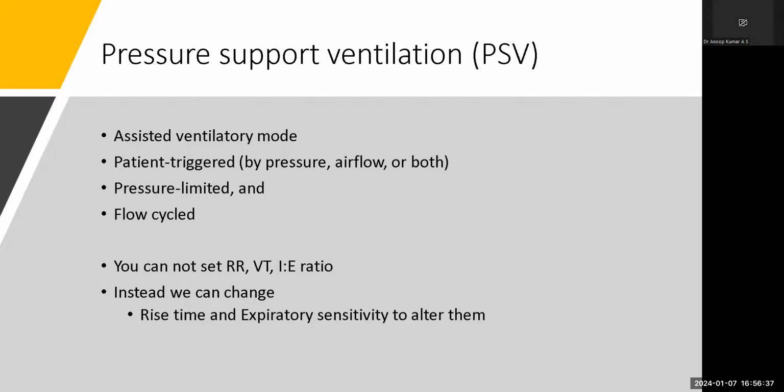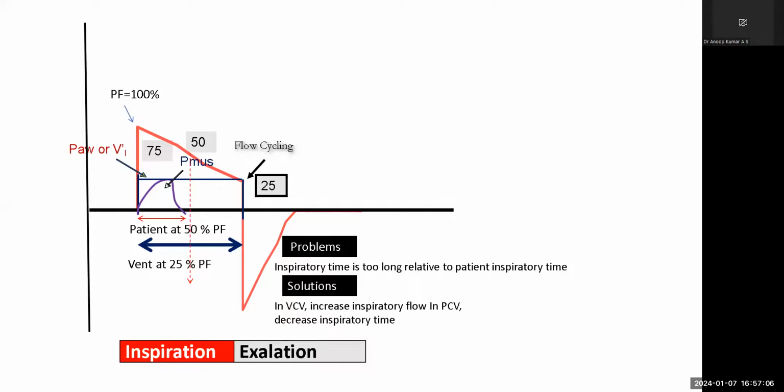Suppose the patient is going into a severe bronchospasm. So at a 12, the patient may be delivering some 150 tidal volume alone. So there is always a chance for hypoventilation in a pressure control mode if you are not constantly watching the delivered tidal volume. The same way, there is a chance for barotrauma in a volume control mode. So you have to constantly watch the pressures, especially the peak pressures, in a volume control mode. Okay, so that is the difference between those two.